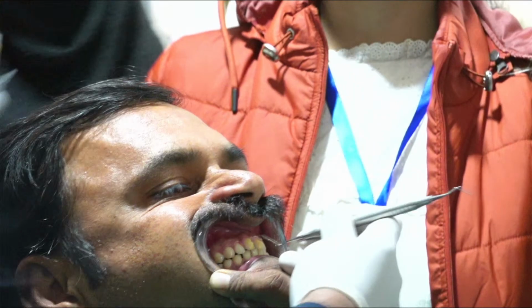Yeah, the mouth mirror is there. Or you can use this tip to have a better spread. We don't have enough at our disposal here. It is our fault also because we should have given them the dish, whatever we require. Lightly.